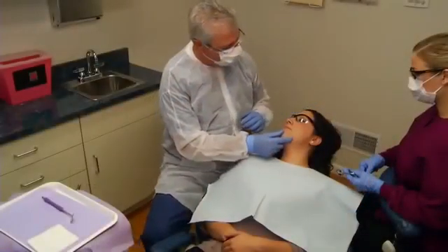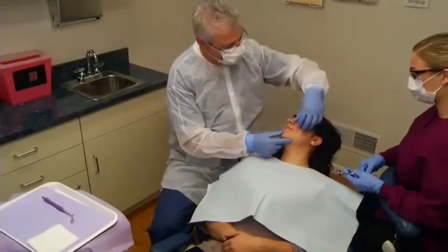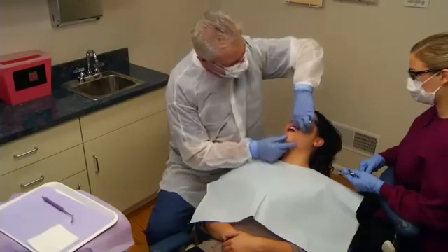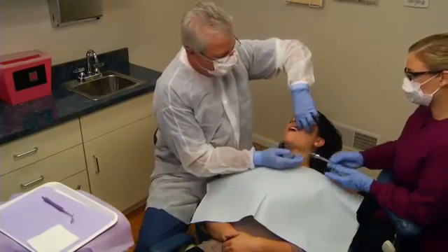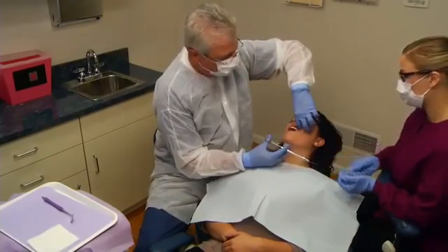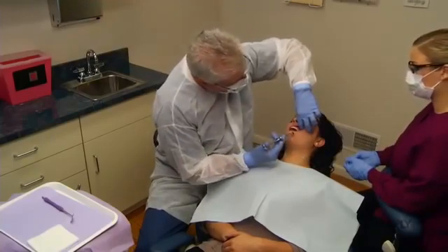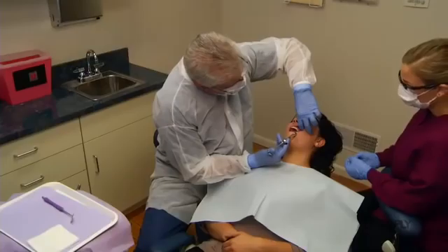For a right-handed operator performing a left infraorbital nerve block, the clinician should sit in the 11 o'clock position, this time with the patient's head turned toward the operator side. The left thumb is used to palpate the infraorbital foramen and the index finger is used to reflect the upper lip. For the left-handed operator, the mirror image of the techniques illustrated in this video may be used.